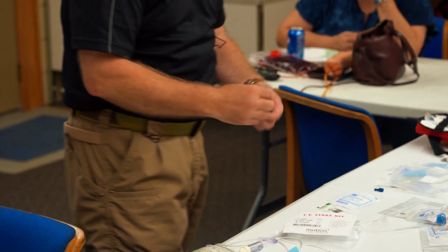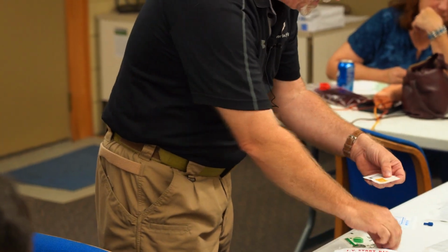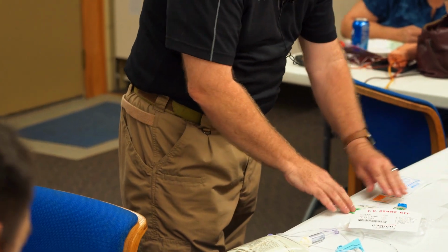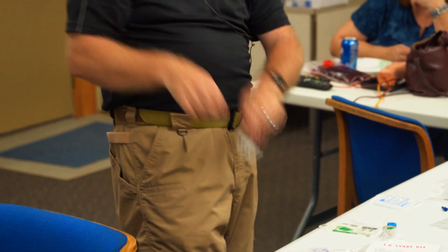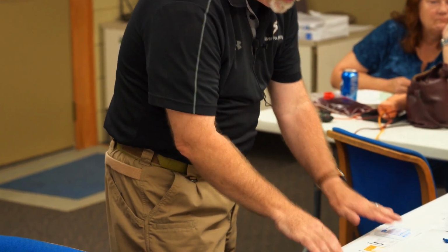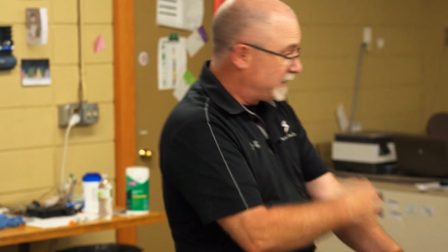So this is your IV start set. A couple of pieces that you're going to find in here are pretty handy. Oh, you guys are doing the iodine. I like that. Do you care, or do you have to? You have iodine and alcohol? I don't use the iodine. Okay. There are varying schools of thought on that, but basically we have stuff to do skin prep.